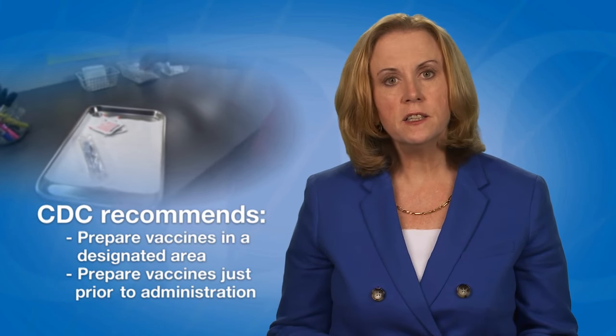Vaccines should be prepared in a designated area that is not adjacent to any area where potentially contaminated items are placed. CDC recommends that providers prepare vaccines just prior to administration.